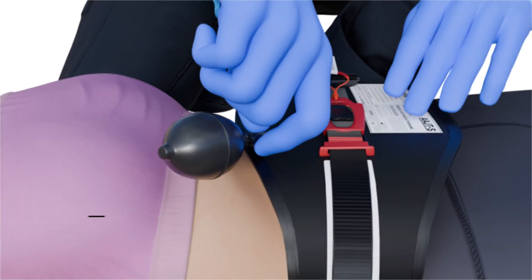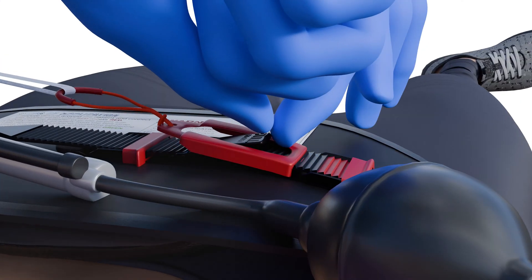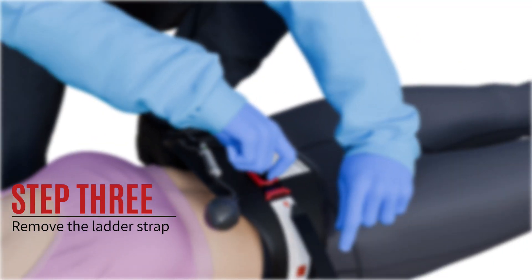Step 1: Deflate the bladder slowly. Step 2: Lift and release the pull tab. Step 3: Remove the ladder strap.